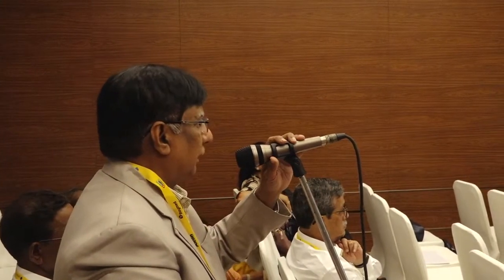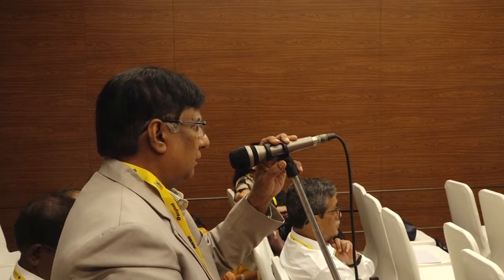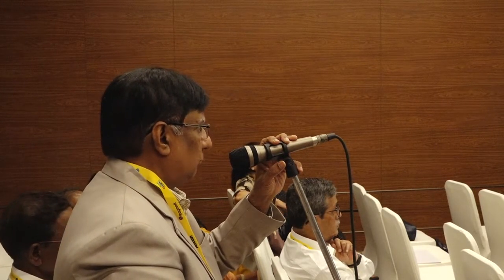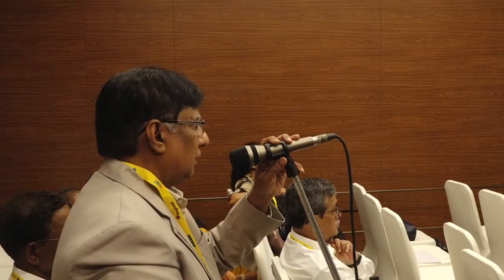That is what I was just about to say, that if you are using ASOCT as a screening tool, then you can pick up those suspicious cases and then subject them to gonioscopy. In fact, gonioscopy may give you small additional information like patchy pigmentation or fine goniosynechiae, which you perhaps could not see in the ASOCT. So then it's easier for you to decide whether to go for a PI or not.